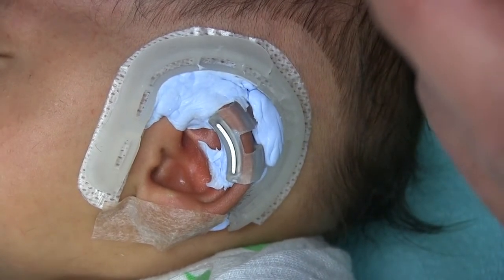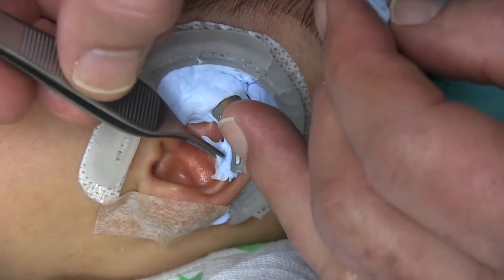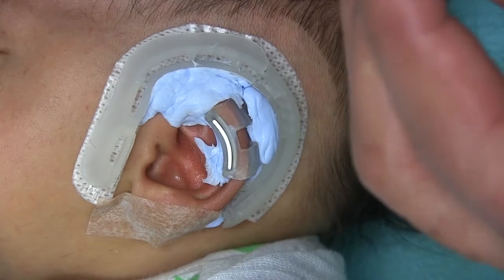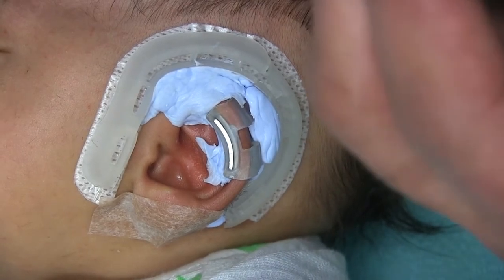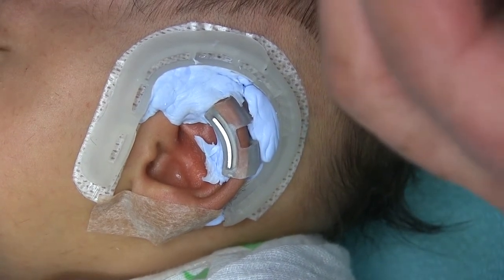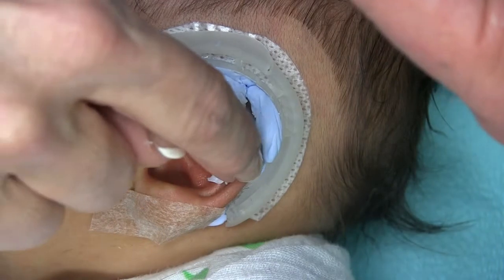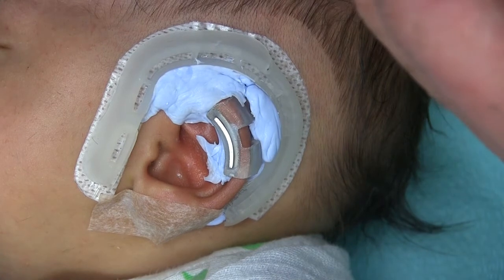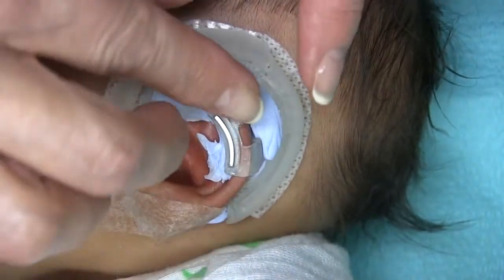So the difference is right across there. Trying to push that back. There — too much. Get that one locked in. Can you get that retractor locked in? Mm-hmm. Okay.